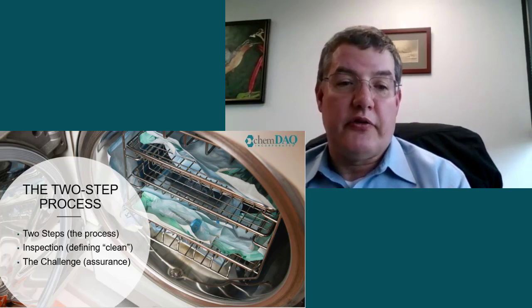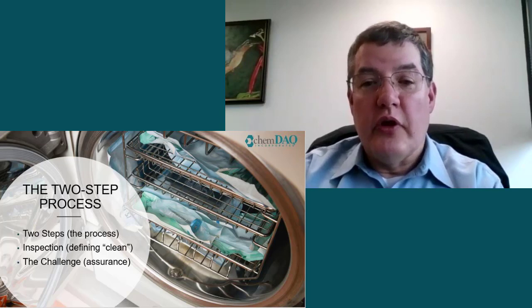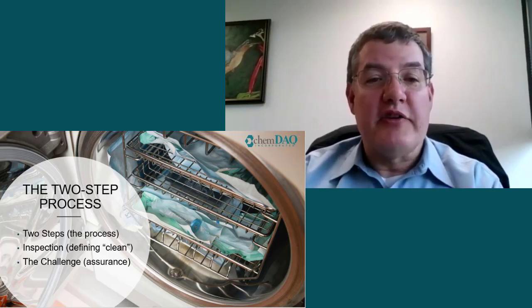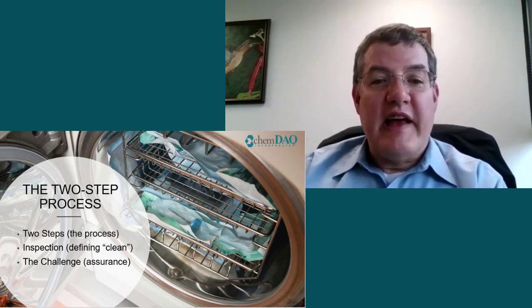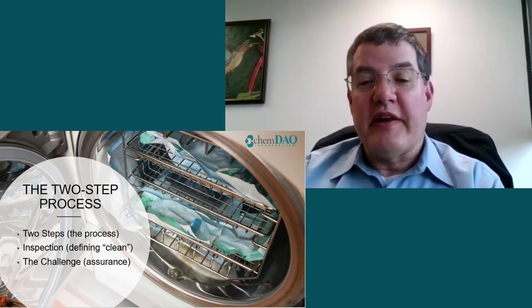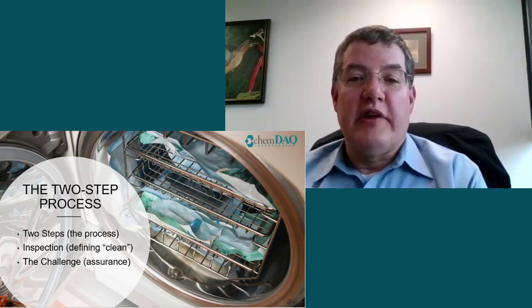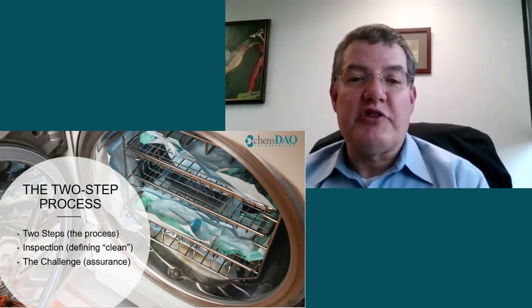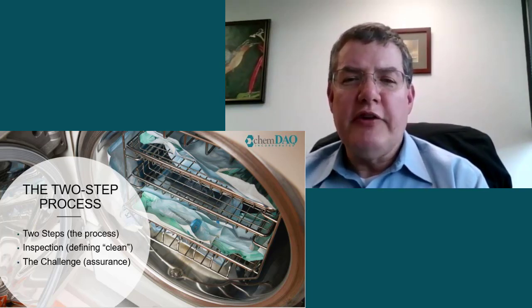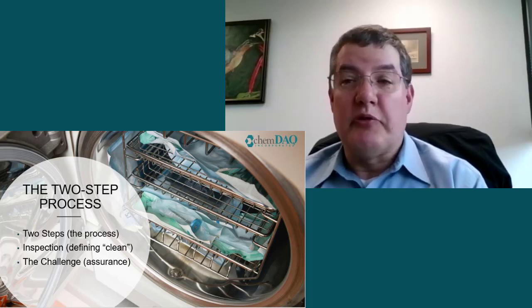of N95 masks. While some studies have shown that the various disinfection methods being used do destroy viruses, few of them appear to have demonstrated a sufficient sterilization assurance level, meaning that there is less than or equal to 1 chance in a million that a single viable microorganism is present on the sterilized item for the process to be described as sterilization. Even in those trials where apparent sterilization has been achieved with model systems, recycled masks are going to have variable biological deposits in them that the sterilant gas may or may not be able to penetrate.